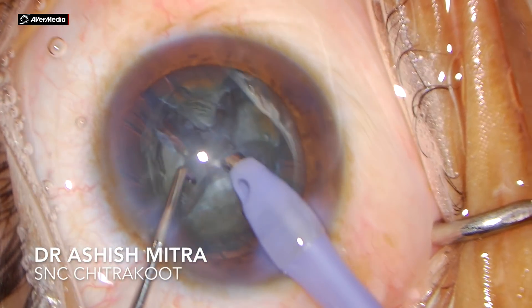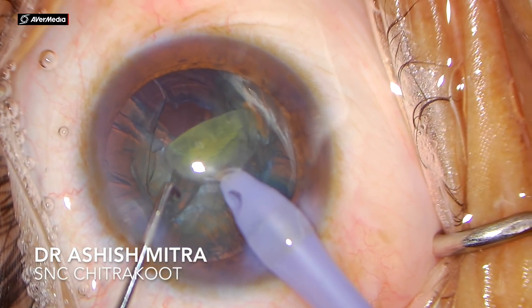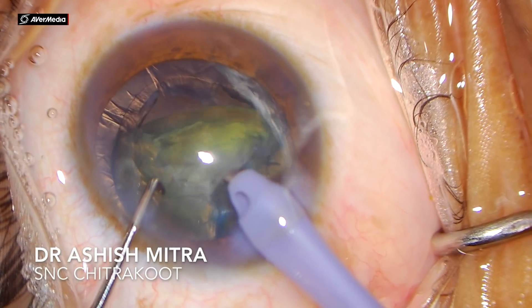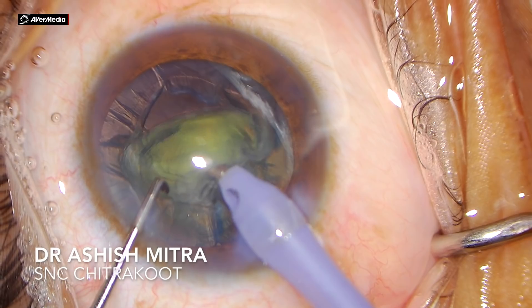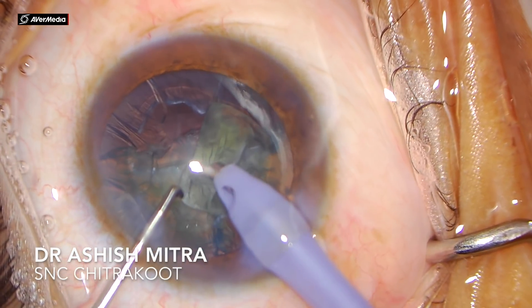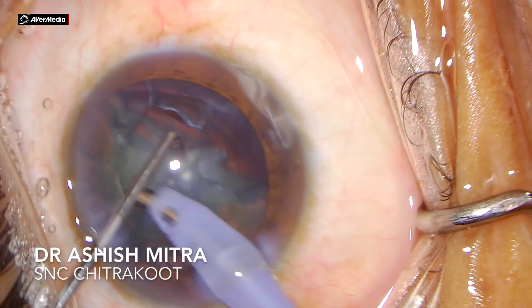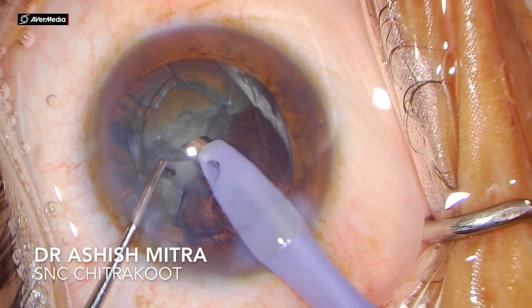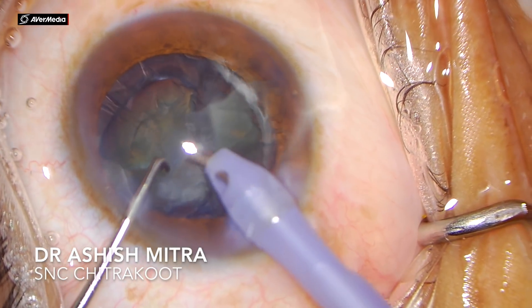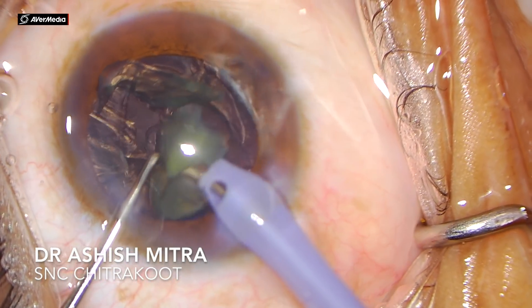The settings in all these phaco steps remain the same as I have discussed in my previous videos. Once you have made these four pieces, with my phaco probe in foot position 2, I just aspirated that piece out into the central safe zone, and then in foot position 3 I'm emulsifying these pieces. You can notice that my chopper is still, because these pieces are so soft that you don't really require the chopper to chop again. With some amount of energy you can just emulsify these nuclei after lifting them into the central safe zone.